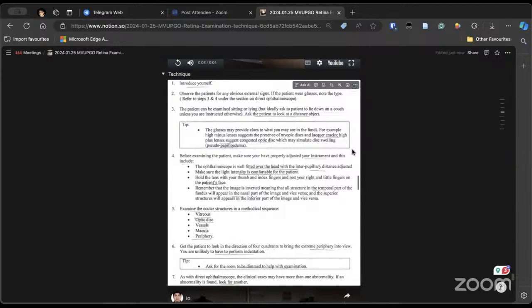So after 3 hours, 4 hours, the pupillary dilation will reduce. So that's why many people have complained that the pupil was not dilated. That's not the correct statement. The pupils usually constrict because a long time has gone by and there has been no supplementation of tropicamide or any dilating drop. So that's where your acumen will help.